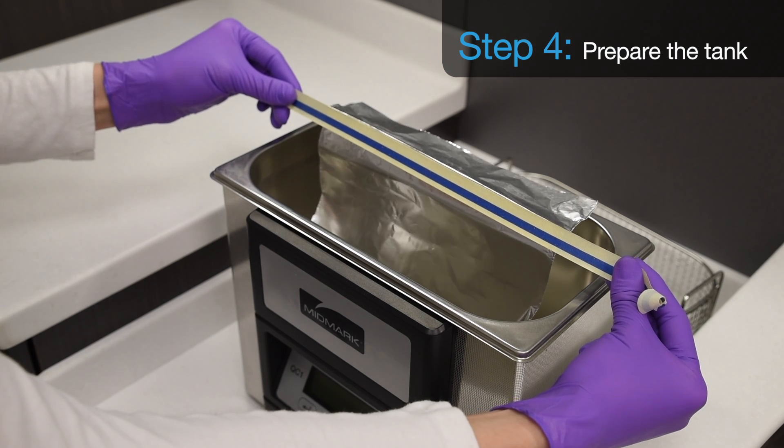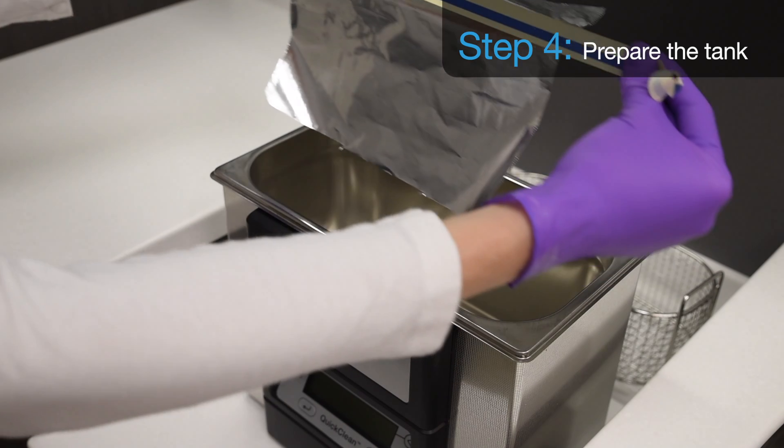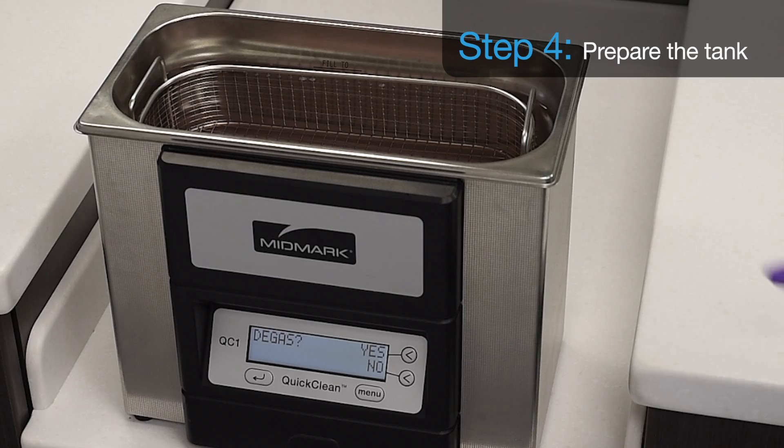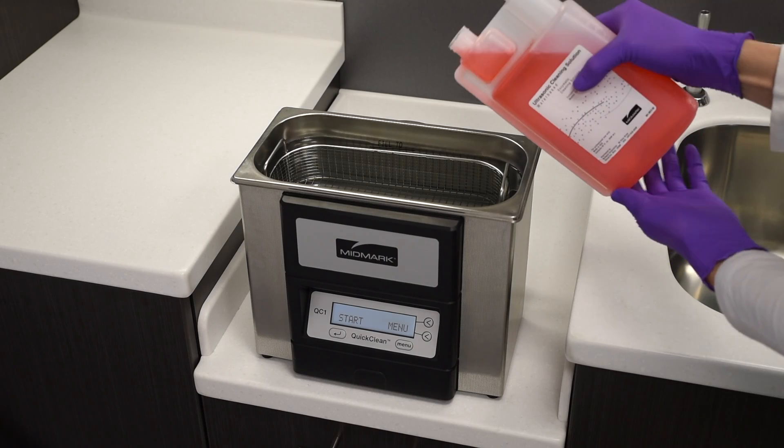Step 4. With the foil test sample removed from the tank, prepare a fresh ultrasonic cleaner solution by filling the tank to the fill line with water. Then add the recommended amount of cleaning solution.